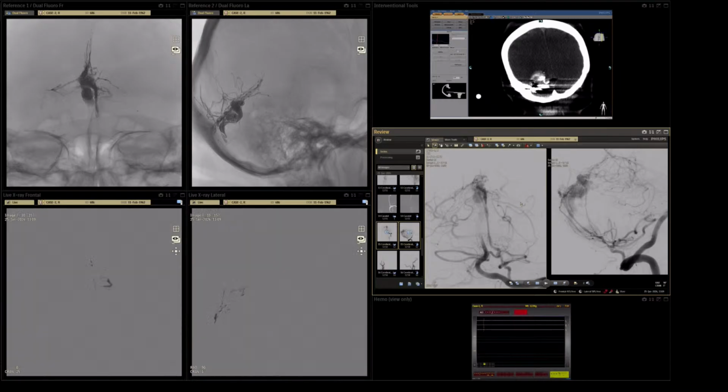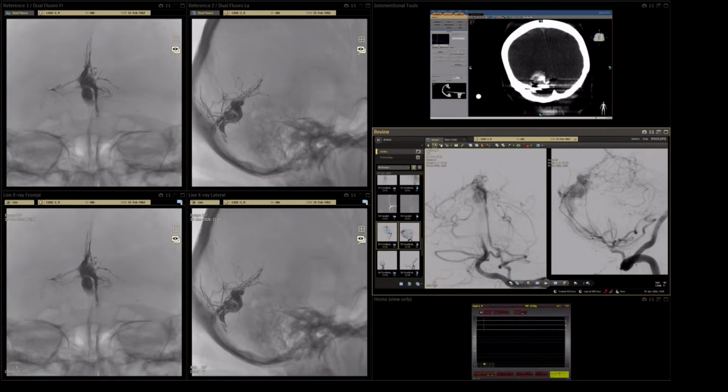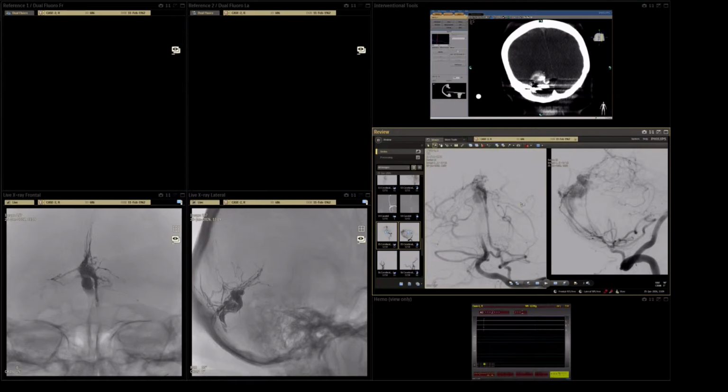It's quite acceptable. Till now, it's nearly 1.5 centimeter reflux, and I hope we can finish. This vein is this vein till this point. On AP, we occluded till here. Also good.